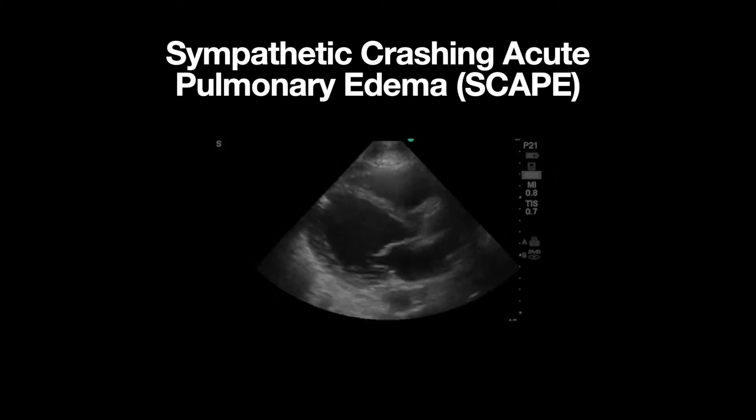This is a video demonstrating ultrasound findings in a patient presenting with sympathetic crashing acute pulmonary edema, also known as SCAPE.